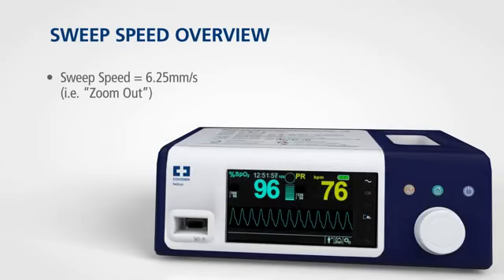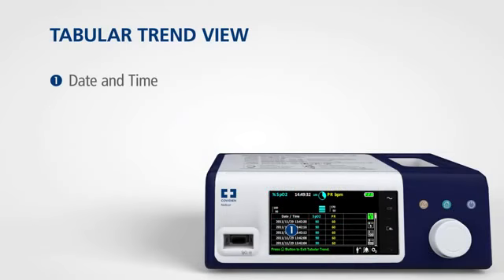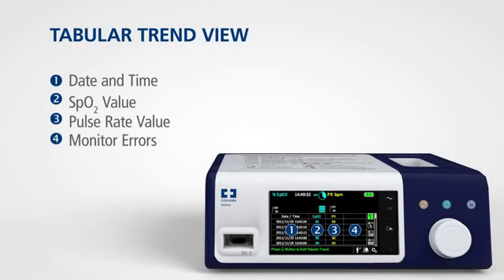The sweep speed view allows you to set the speed at which the SpO2 waveform trace moves across the screen. The higher the sweep speed value, the more granular the data that appears on the screen. The monitoring system presents trend information in tabular format for all monitored parameters when you enable this option.